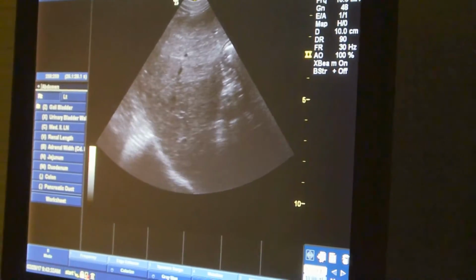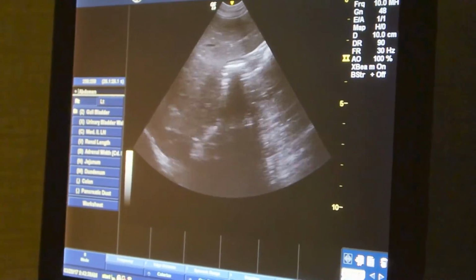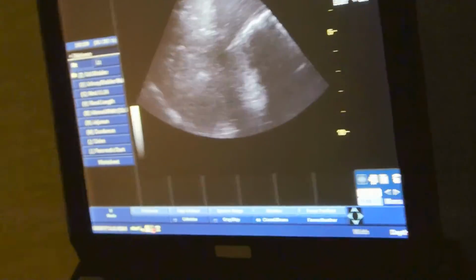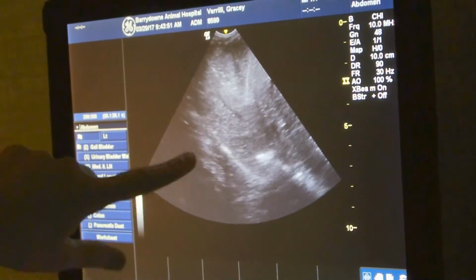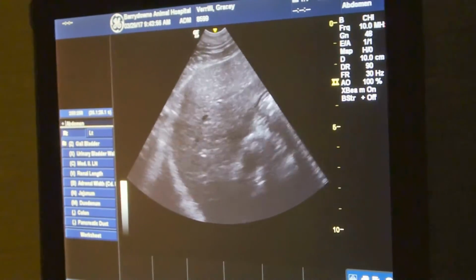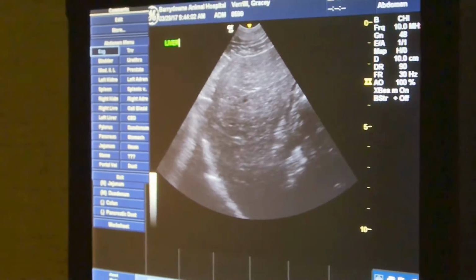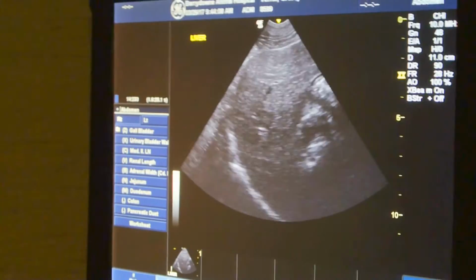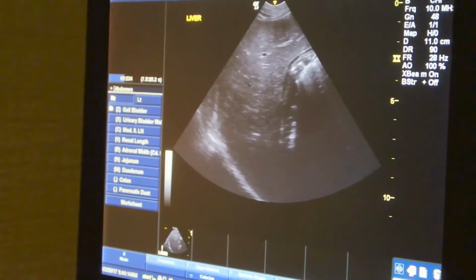It sort of looks like an optical illusion, like those 3D books that you used to have, where you had to adjust your eyes to see the picture properly. When you don't know what you're looking at it's confusing, and when you do know what you're looking at, it's really clear what we're seeing. Oh, you can actually see her diaphragm and her heart beating on the other side of it. Alrighty. Good job, Grace.